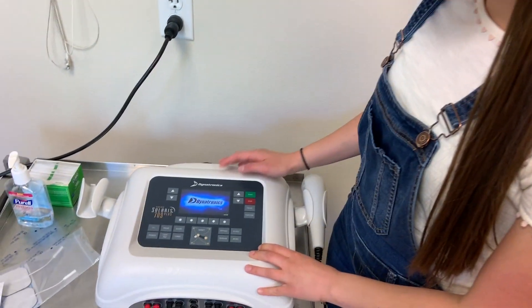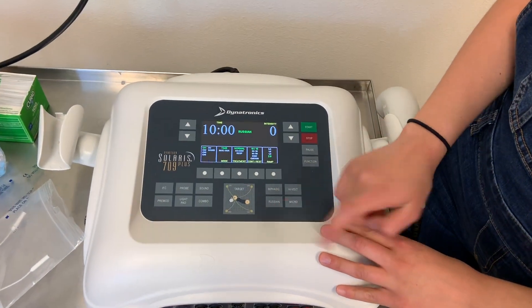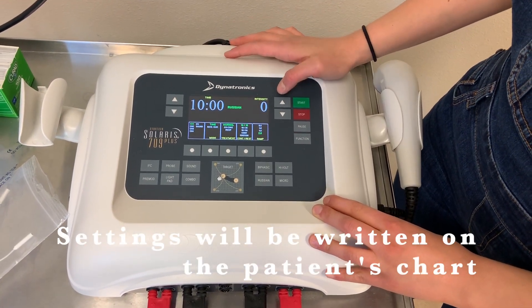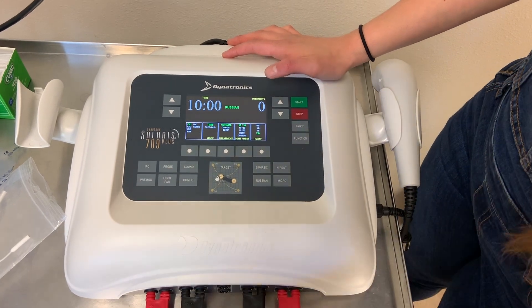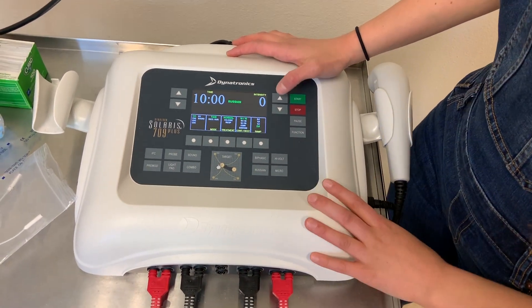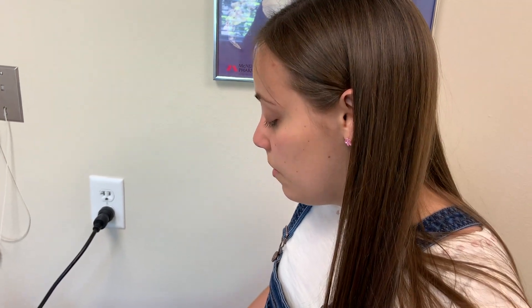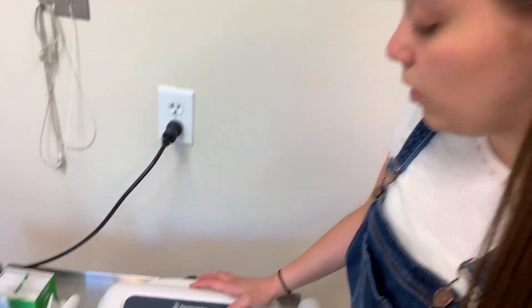As the pads are on, I'm going to come over to the machine and press Russian. The settings are already set up how we want them, and I'm going to slowly start. I'll also make sure it's on the right channel. Then I'm going to start turning up the intensity. If it gets up to around 30 and you're still not seeing a contraction or getting the results you want, you might want to try readjusting the pads or talking to the therapist to see if they can place them a little bit better.